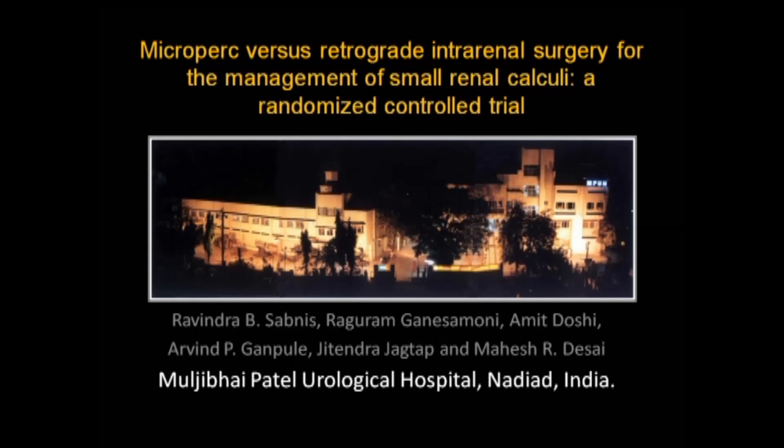We conducted a randomized control trial comparing microperc and retrograde intrarenal surgery for the management of small renal calculi. In this video, we describe our technique of microperc initially.